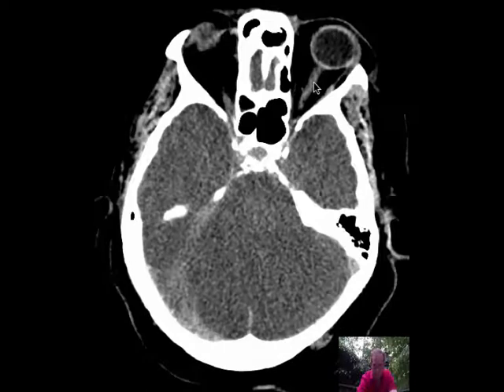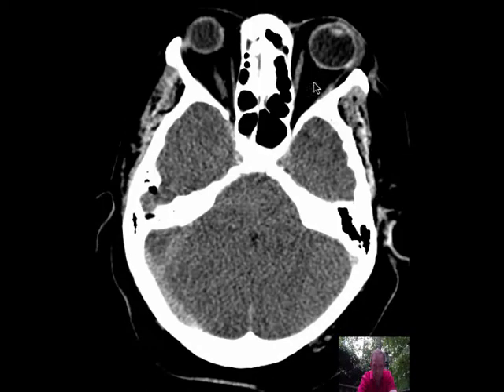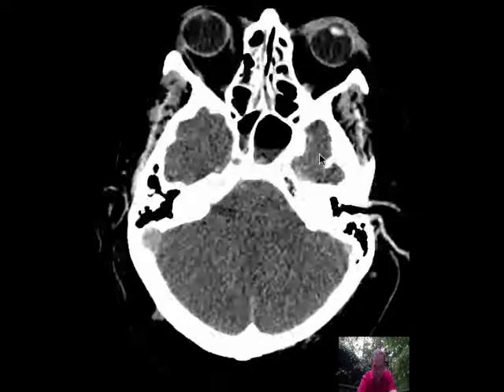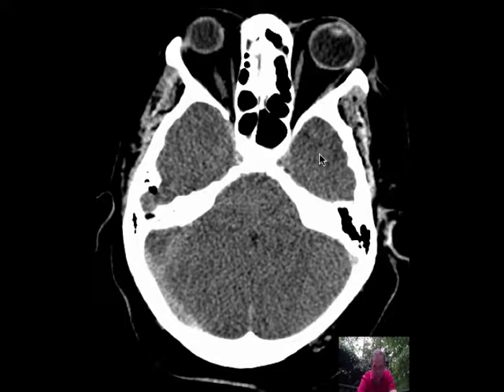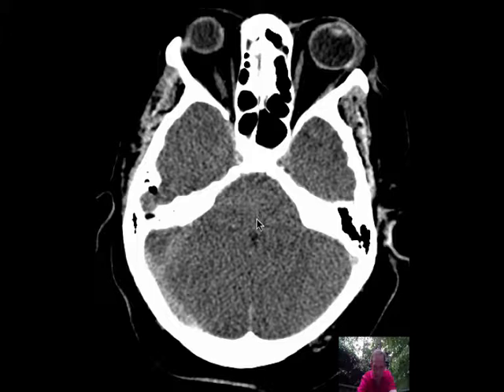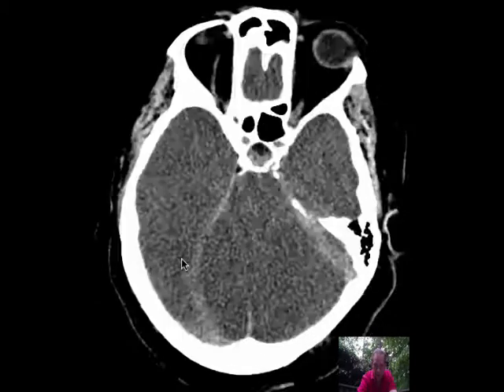Let's look down in the posterior fossa. The anatomy is very poorly visualized. The fourth ventricle itself appears very small. You can't really see any of the folia of the cerebellum.